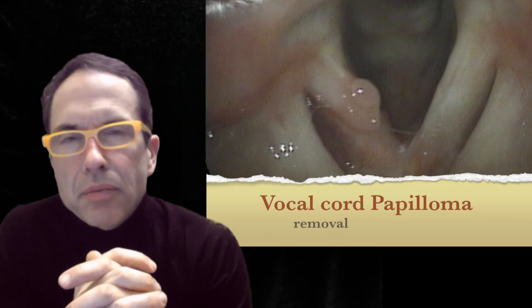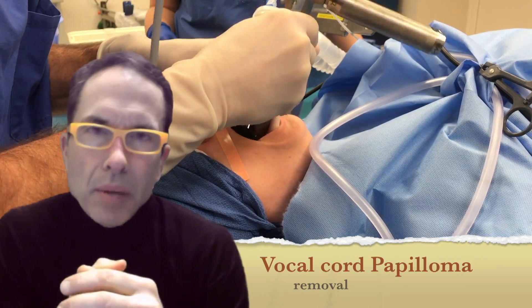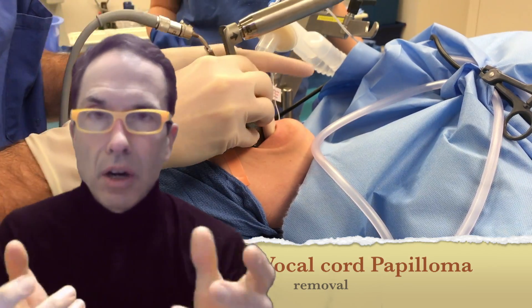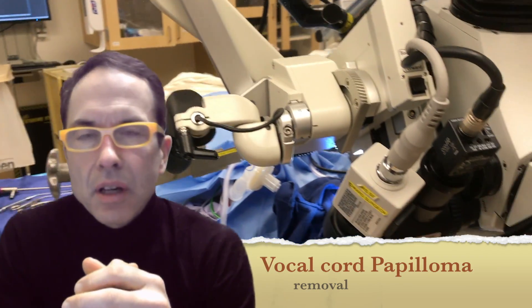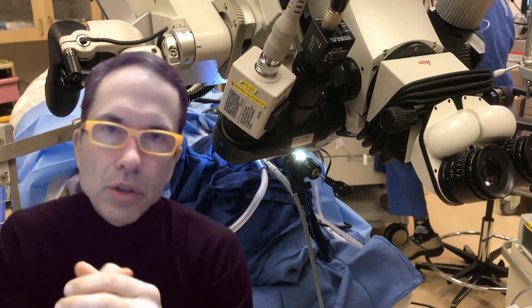Hello, I'm Dr. James Thomas. I'd like to walk you through how I treat vocal cord papillomas, specifically how I remove them. I'll begin by talking about why it's indicated and then how I use the tools that I use.